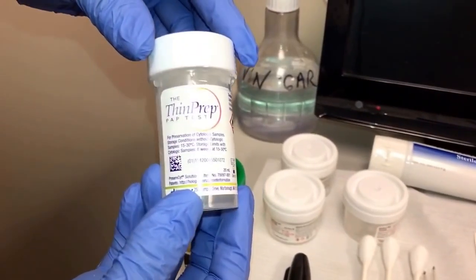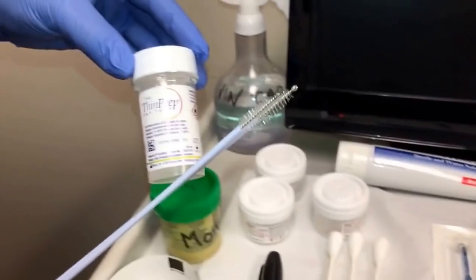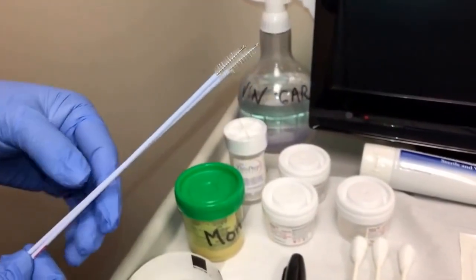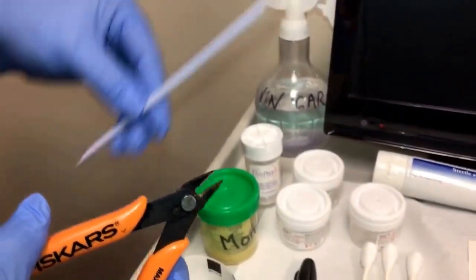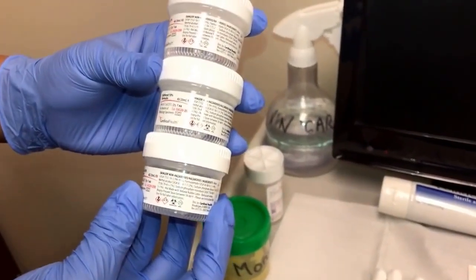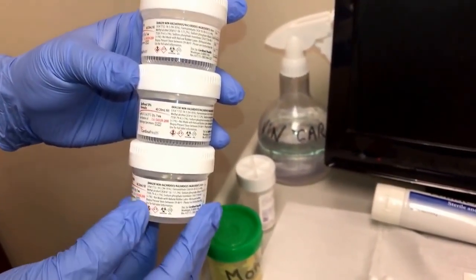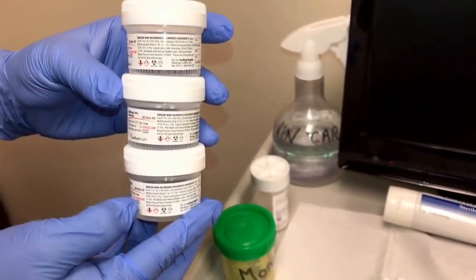This vial here is for the ECC biopsies. Those would be collected on these brushes here, which would then be cut by these wire cutters into this vial. These other vials are for the biopsies taken by the provider, and it is up to the provider whether they want all the biopsies in one container or separated individually.